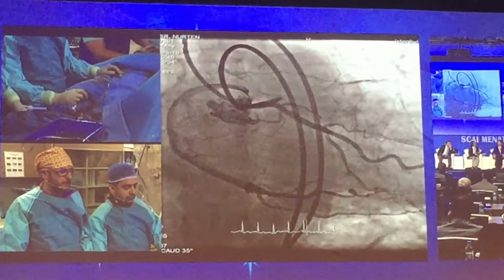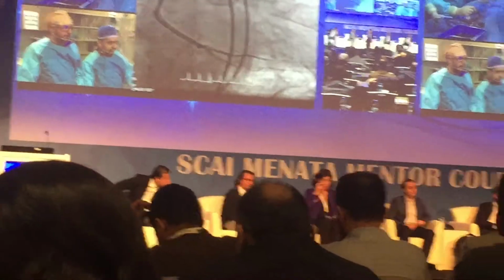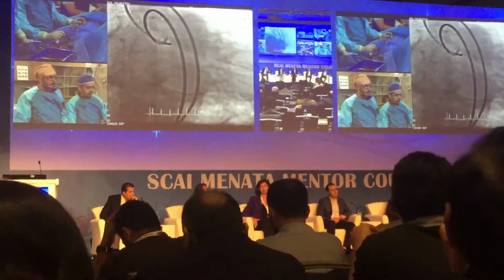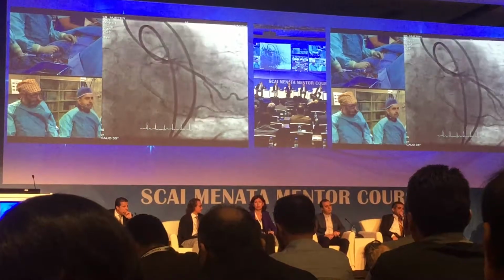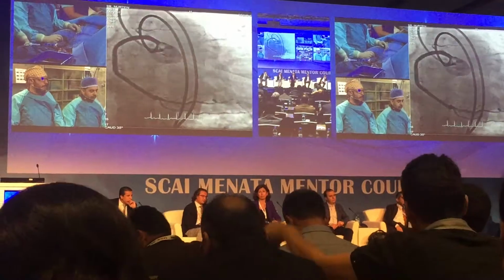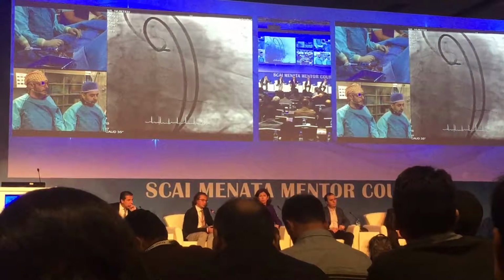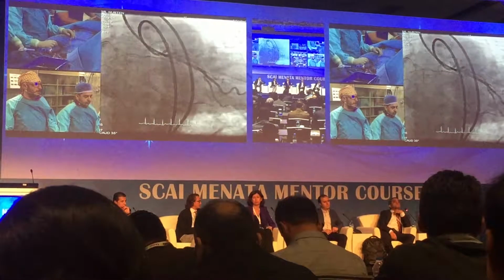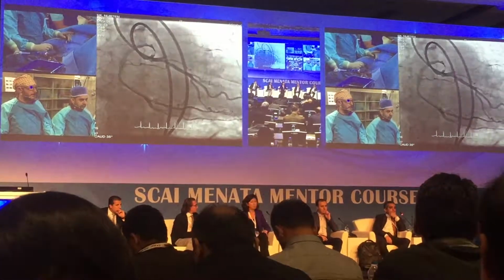I prefer Miracle 12 because there is an in-stent restenosis, but it seems to be a straight CTO lesion. There is no visible channel. I don't start with a Fielder C or a similar wire. You are choosing directly stiff wires for direct penetration.